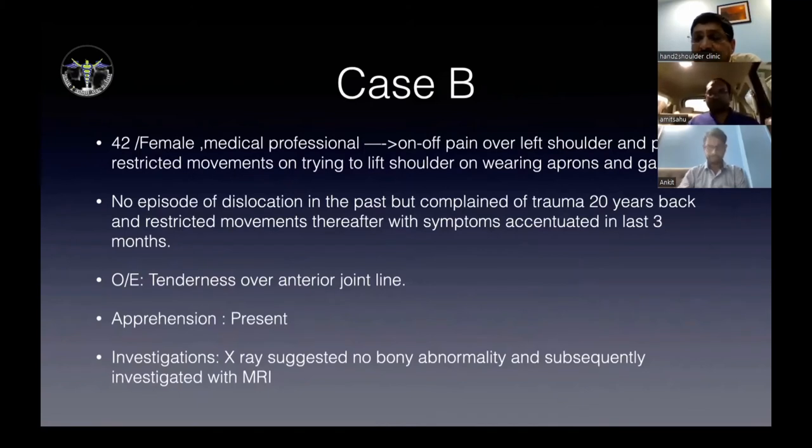Earlier we used to get both a CT and an MRI. Is there any particular protocol we should ask for? Many places call it a dislocation protocol, where we do those sequences along with a thin section of the sagittal T1 or T2. We also have 3D imaging in MRI. But when I personally compared the 3D image with the routine sequence thin sections, I saw that we can say all of those things in the routine sequences if we do a routine protocol properly. So you mean to say there is a different protocol for instability?